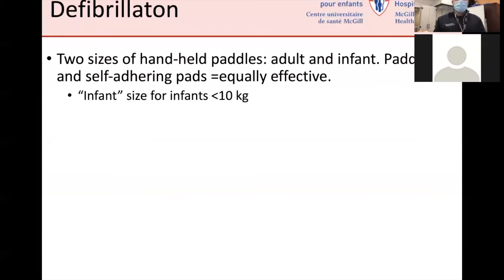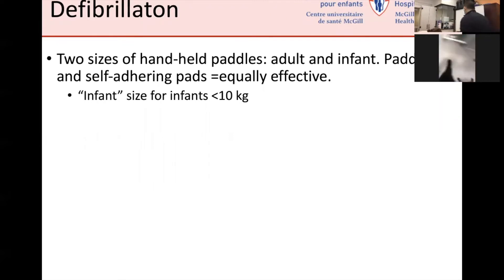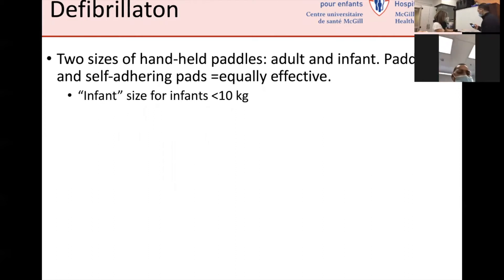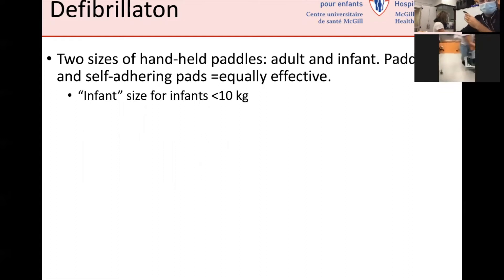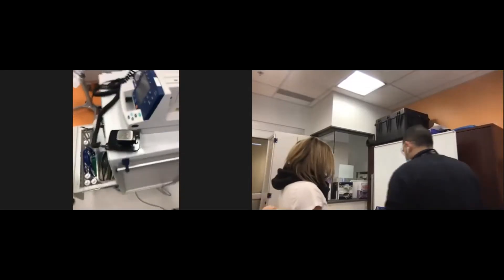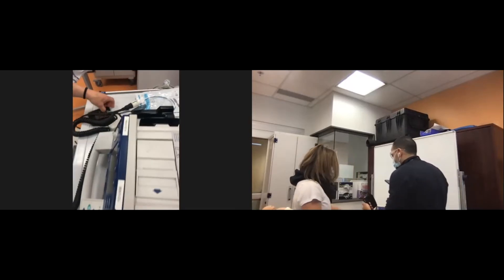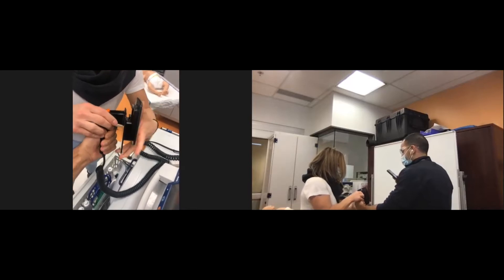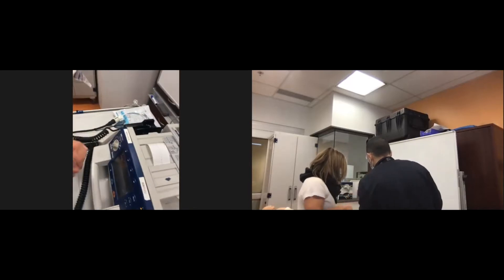There are two sides to the hand-held paddles — adult and infant size. The paddles and self-adhering pads are equally effective. The infant size paddles are for infants less than 10 kilos. To switch from adult to infant size, there is a little button on top — press it and pull at the same time to reveal the pediatric side.